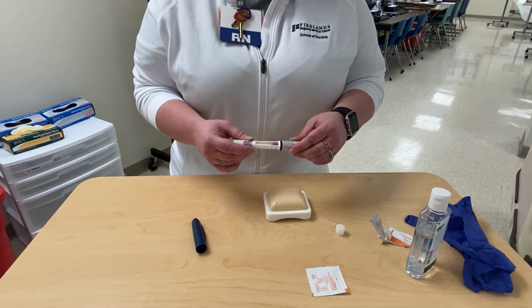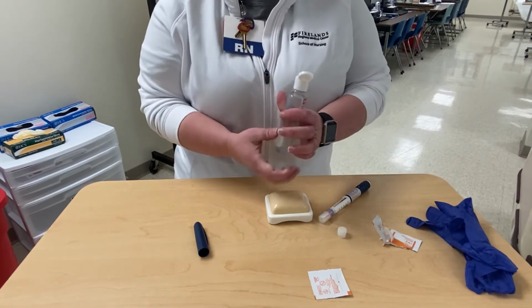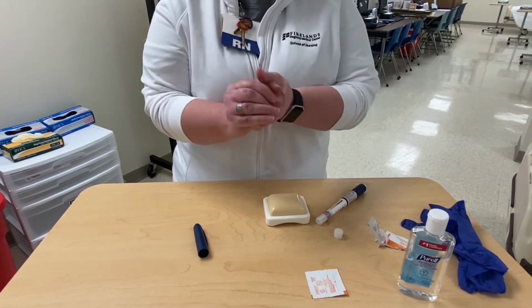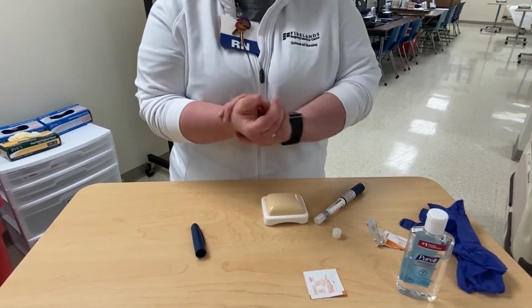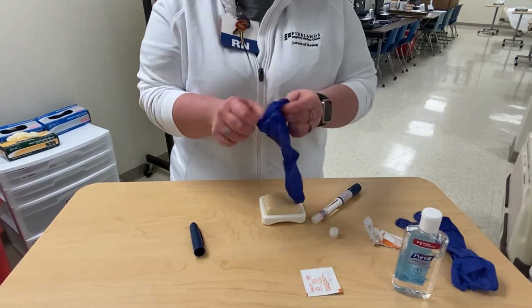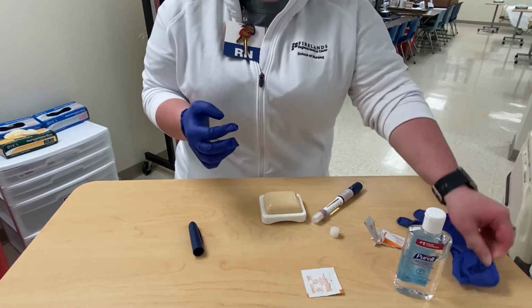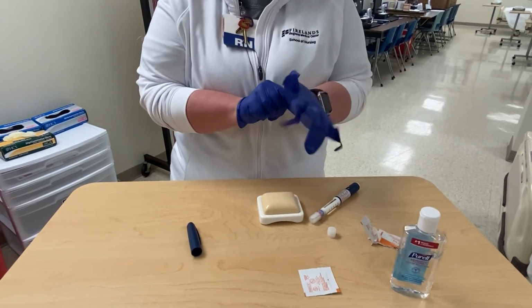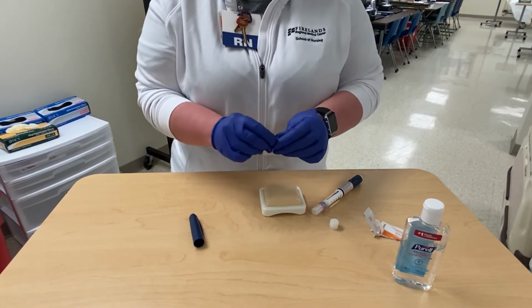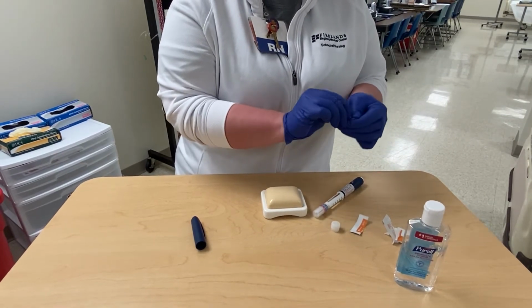For administration of the insulin, perform proper hand hygiene. And then place clean gloves onto your hands. Prep the patient's skin with an alcohol swab in a circular motion for 15 seconds.